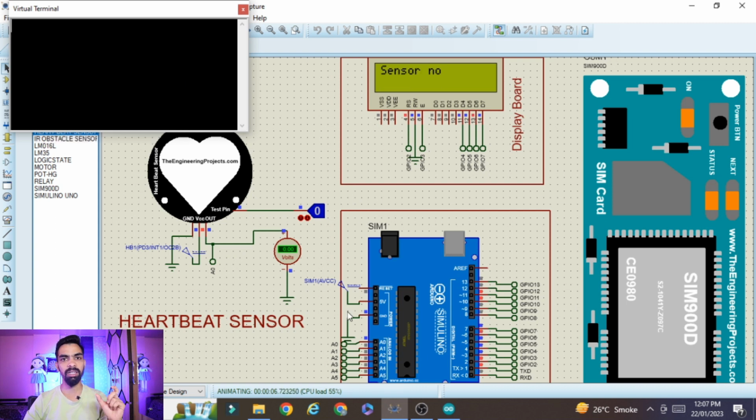Because I have set the time to read the heartbeat within 10 seconds. If you have the patience and if you want to read the heartbeat within 60 seconds, then I will tell you in the program you can remove that timer or you can increase the timer and you can easily detect the heartbeat within 60 seconds. But for the time being I only use 10 seconds, and within 10 seconds if the heartbeat count is, let's say, 8, then it will be multiplied by 10 and you will get the final count. So this is the logic.